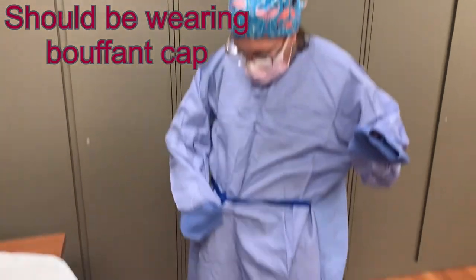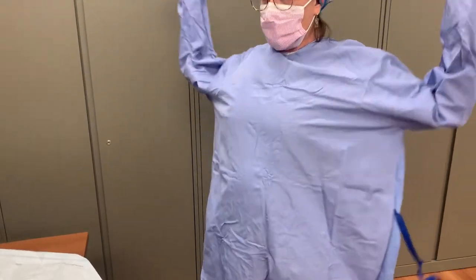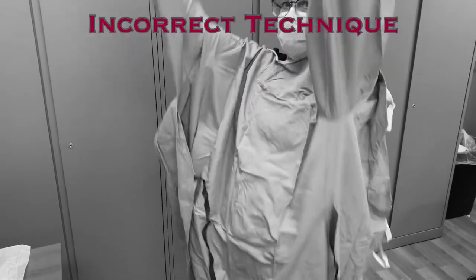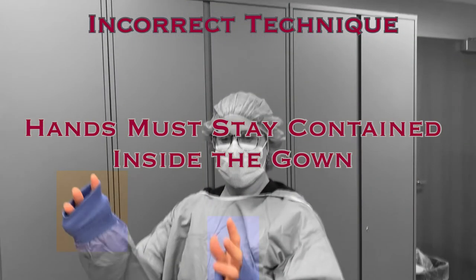With your hands still in the sleeve's cuff, untie the gown in the front. You will need an assistant to tie the back of the gown at the waist. Continue to maintain your hands inside the gown at this point. Sometimes people will stretch their hands out of the sleeves as they are donning the gown, or people with long arms may find it difficult to keep their hands inside. Be aware of these issues and limitations — it is important that your hands remain inside the sleeves during the donning process.